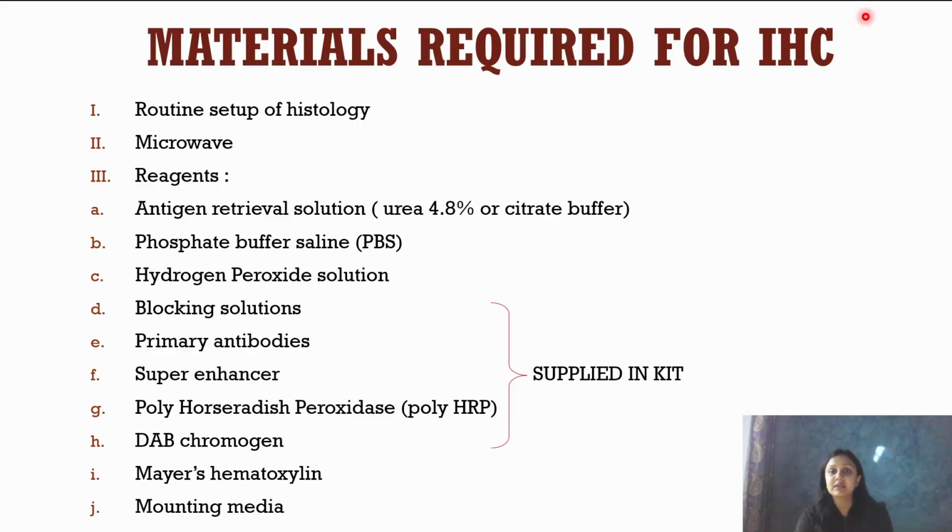So regarding the materials which are required for IHC, there needs to be a routine setup of histology, right? Then comes your microwave, then your reagents. So reagents include all of these reagents, which we will be reading about step by step over the following few slides.